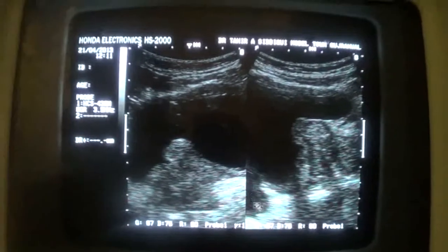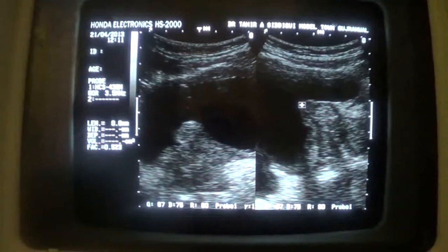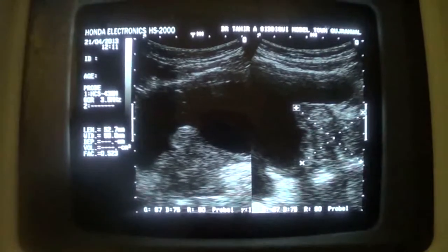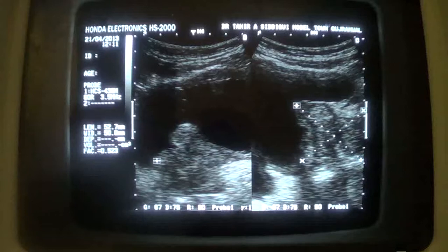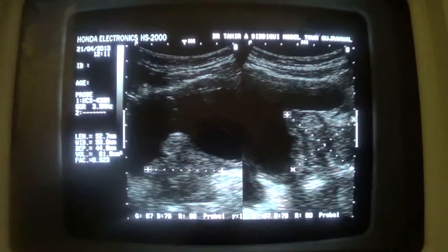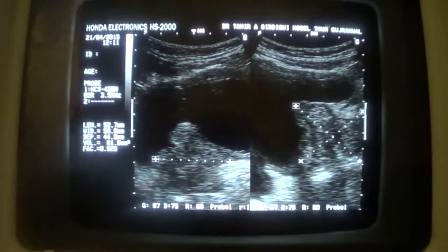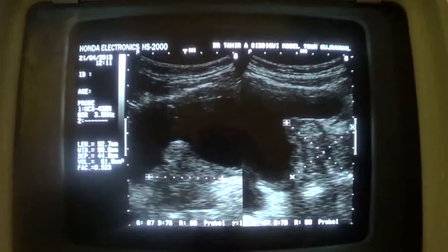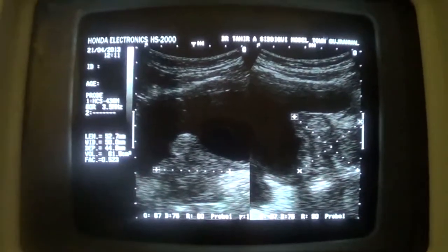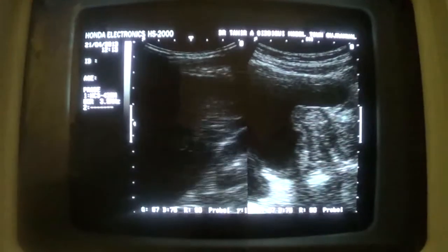This is the diverticulum that we were talking about. If we measure the prostate, it measures 61 grams with a 12 mm enlarged median lobe of the prostate indenting into the posterior wall of the urinary bladder. The prostate is enlarged, the median lobe is enlarged, and we also see a diverticulum.